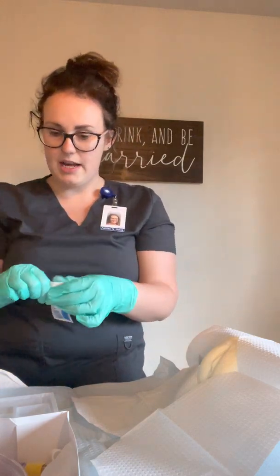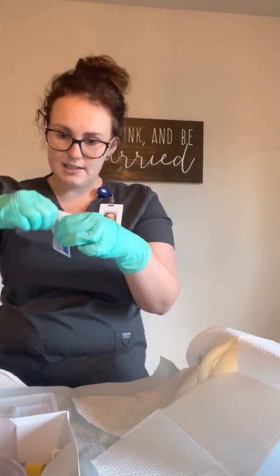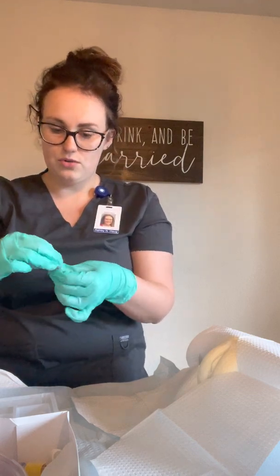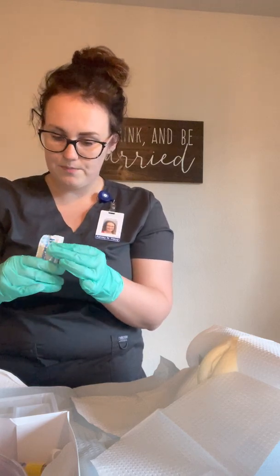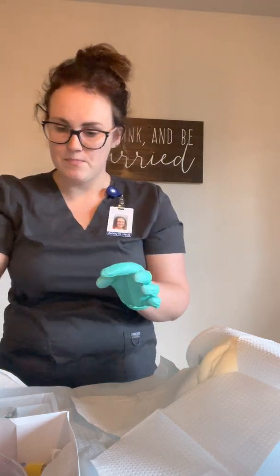I'm going to take my lubricant and I'm going to apply that to the catheter. I'm just going to open that up for now.